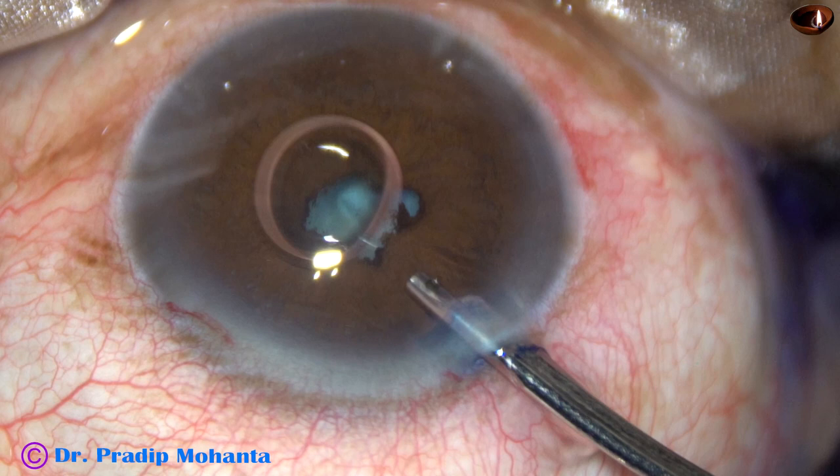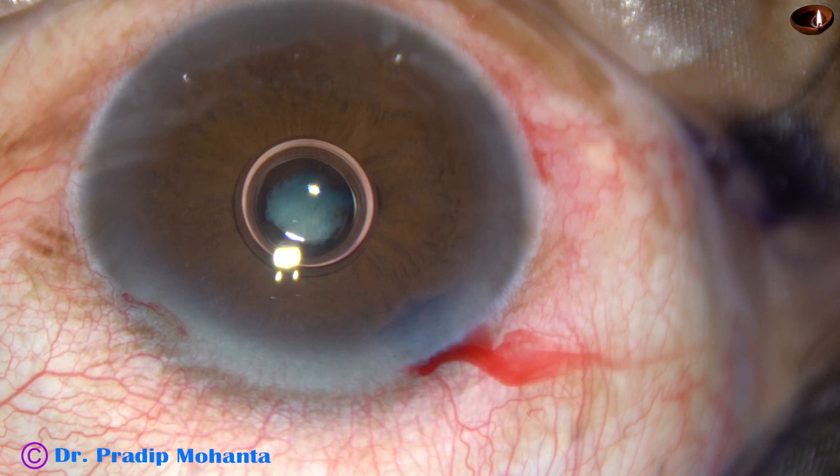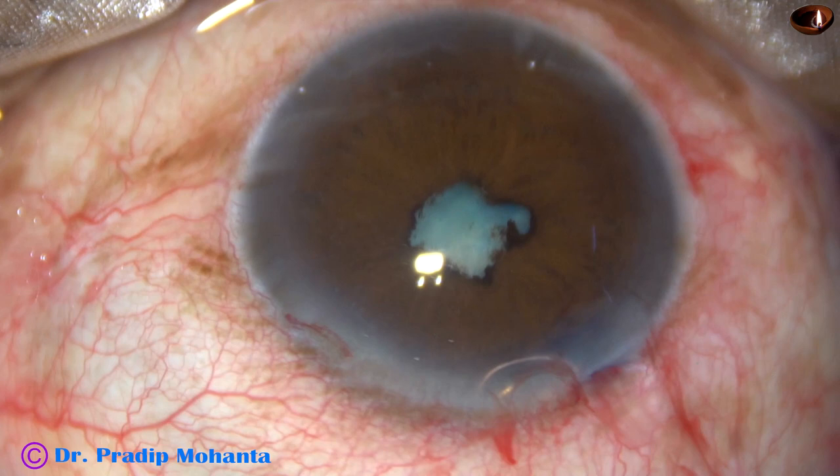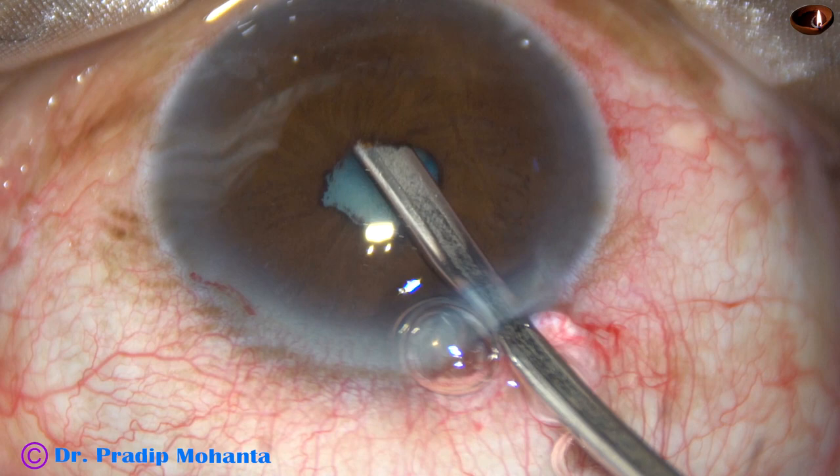Then 2% hydroxypropyl methylcellulose is injected into the anterior chamber. Now I take a 23G Simcoe and break the synechia. You can use any blunt instrument to break the synechia.